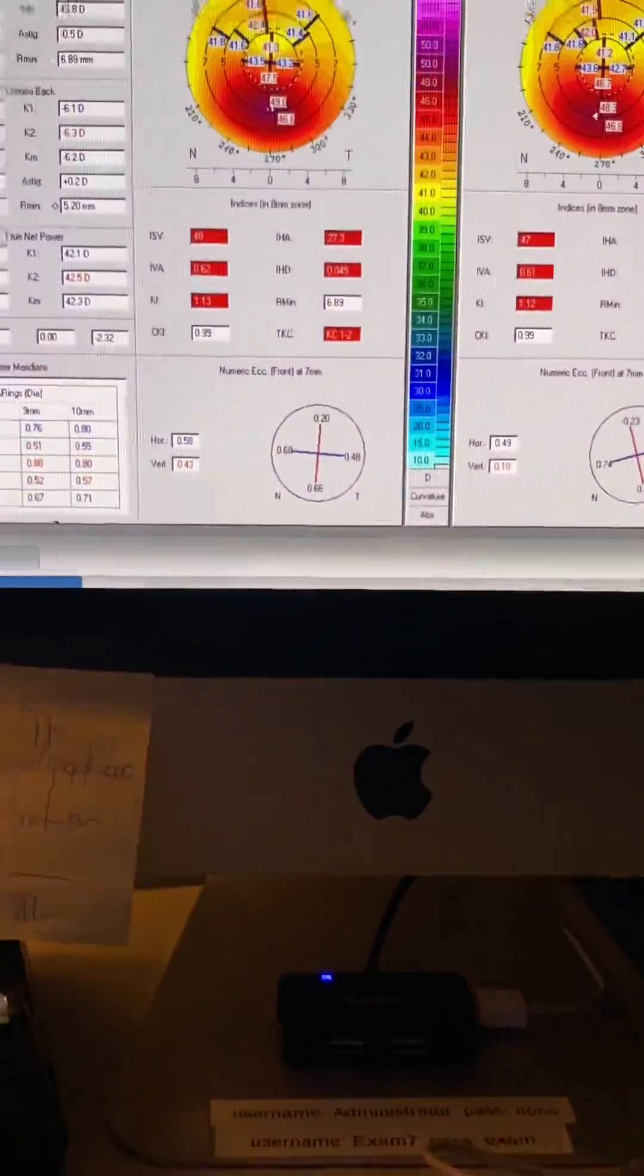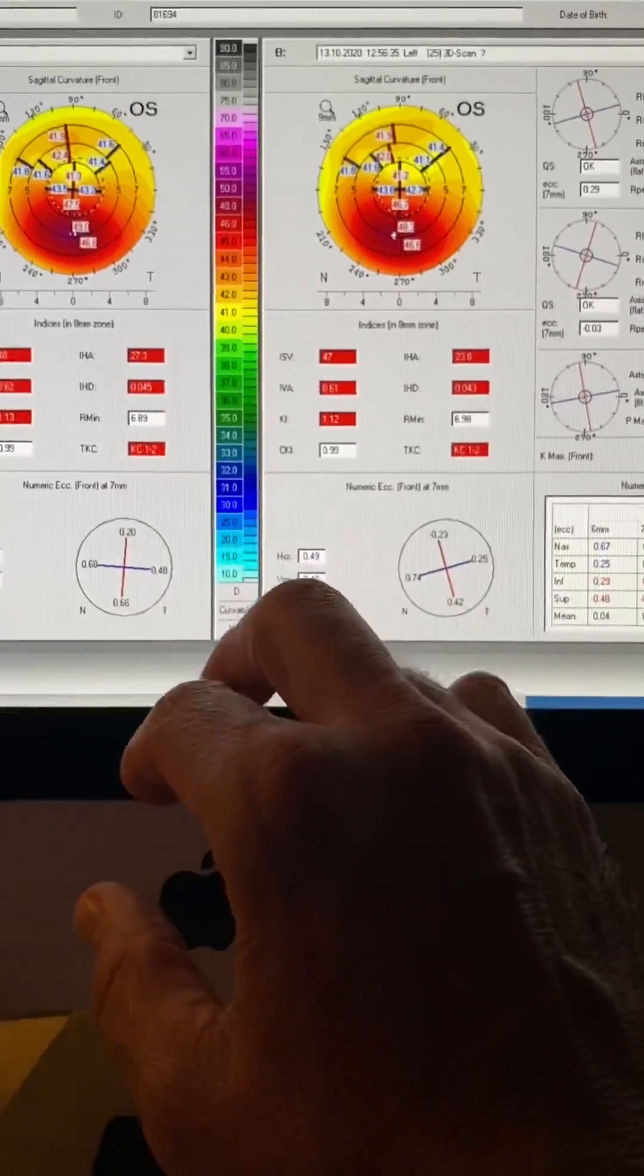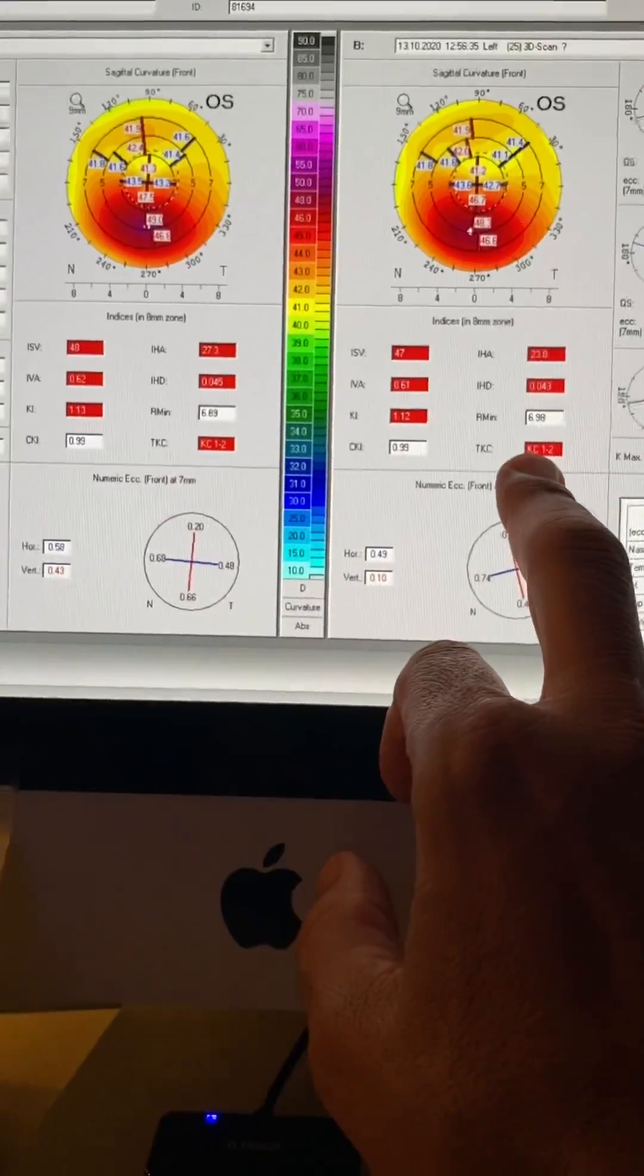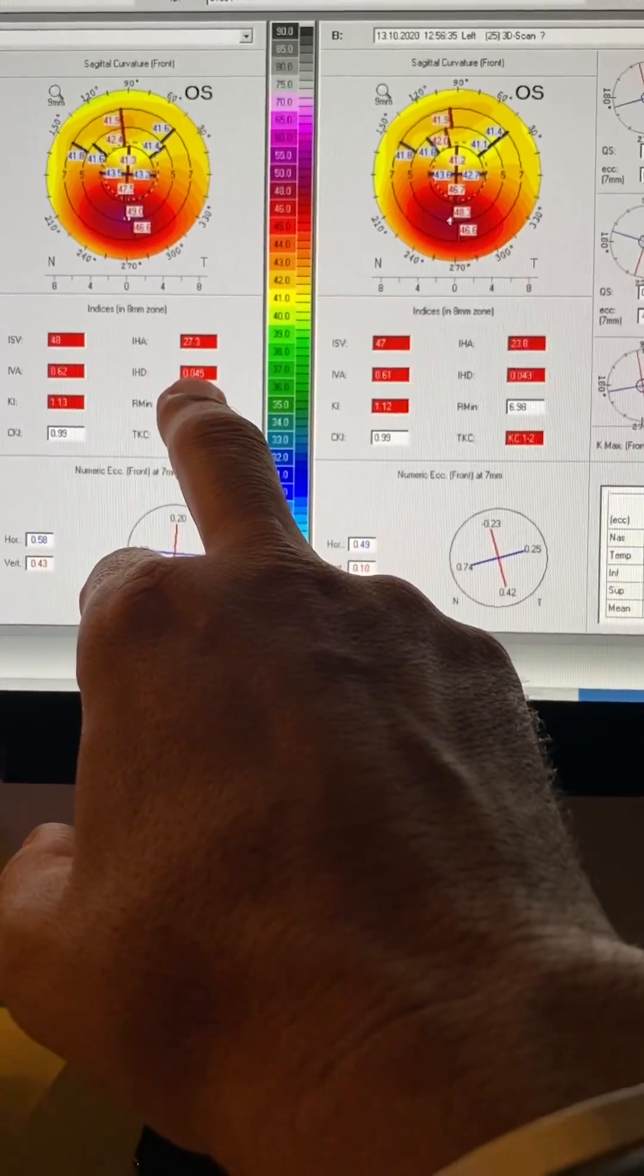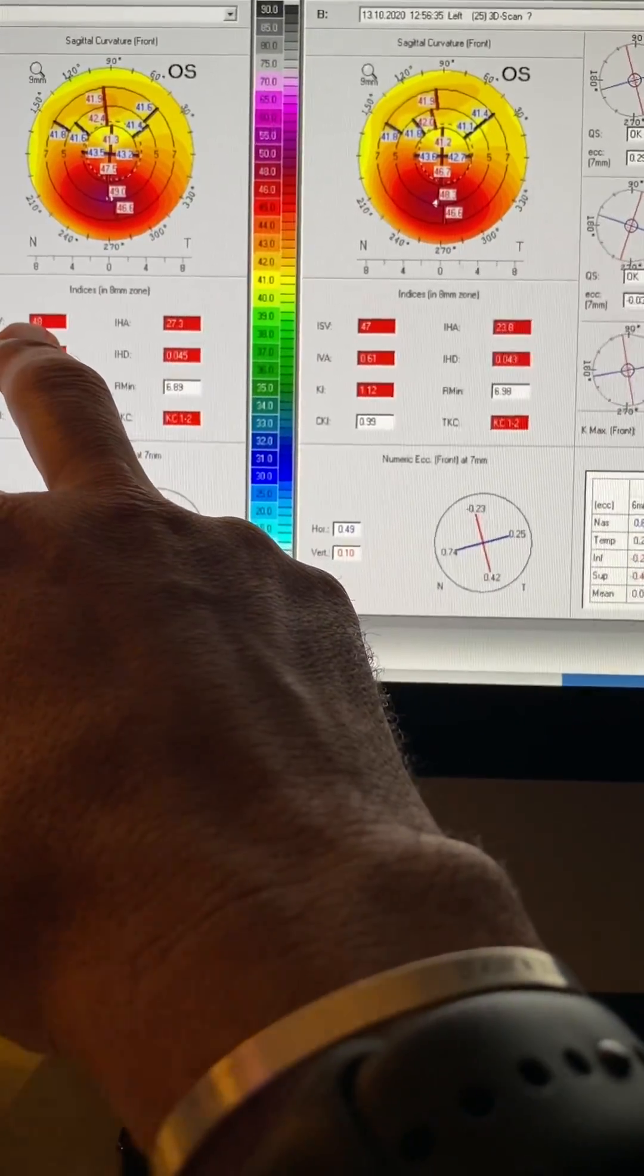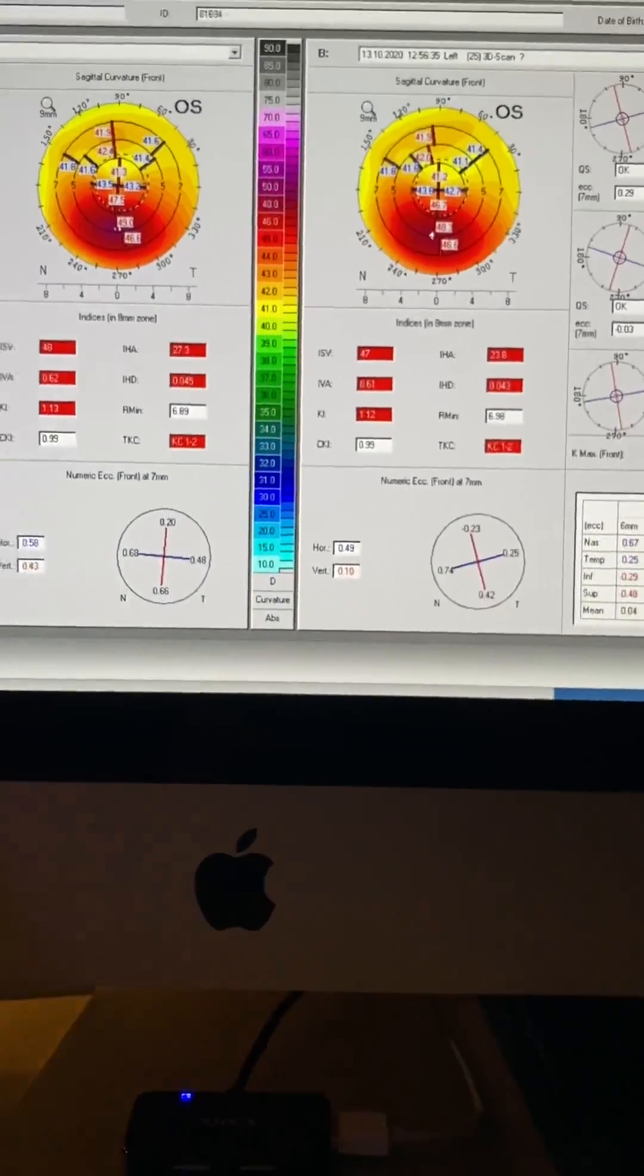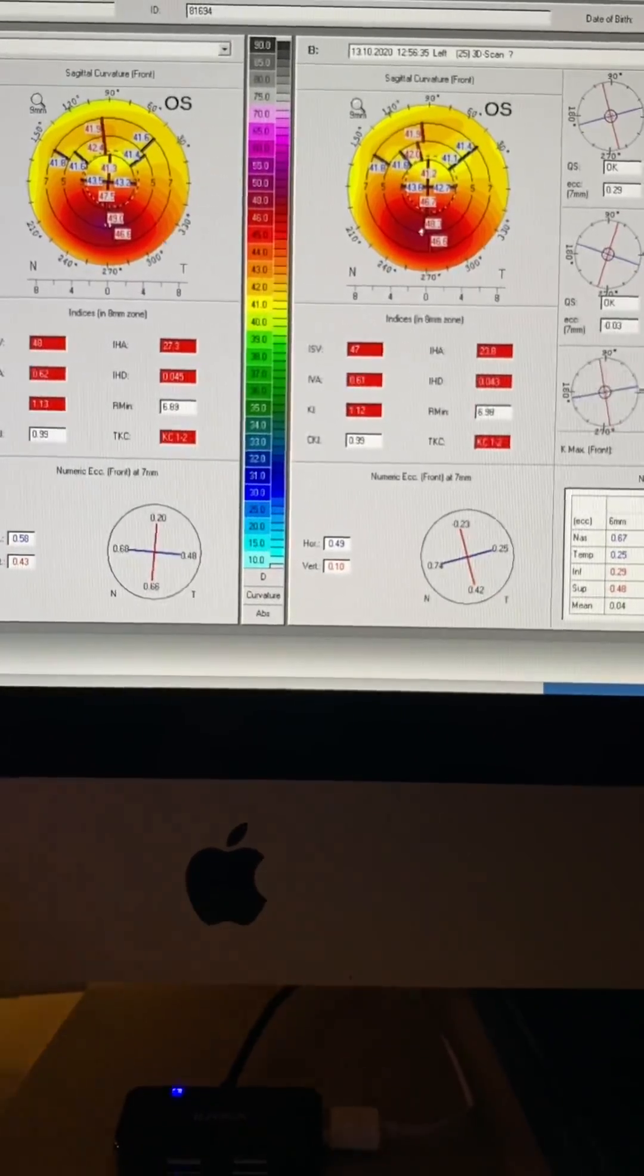Let's look at the other eye. We're looking at the topometric indices here of the left eye. Keratoconus stage one to two last year, one to two this year. IHD 45, 43, ISV 48, 47. So all the numbers look better. And her vision is stable. She's at 20/30.